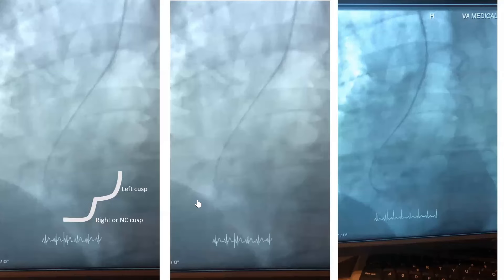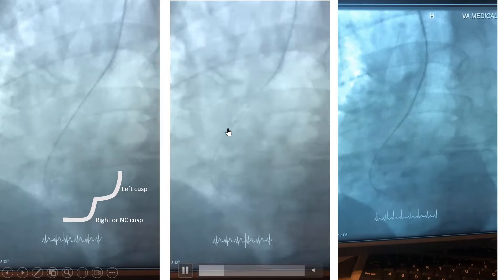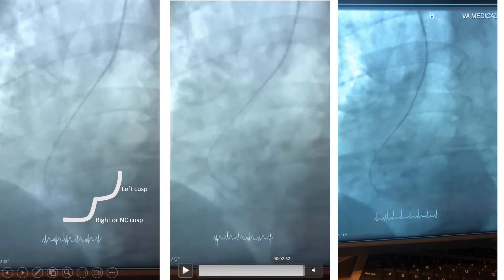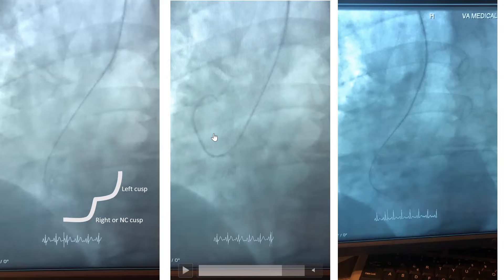Here is an illustration where the fellow just shoved the catheter down without finesse, and it looped on itself and pulled up the wire. When this happens — the catheter loops because you shoved it — don't just re-advance the wire, because the wire will keep going back into the innominate. Instead, pull the catheter back first, then re-advance the wire. This way, the catheter will not make your wire point into the innominate and the arch.